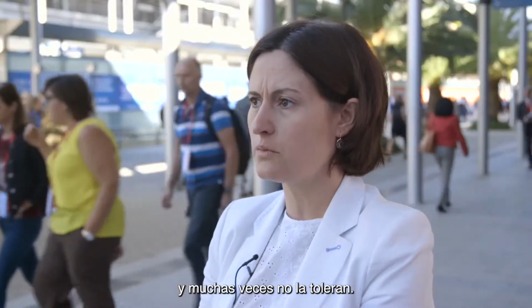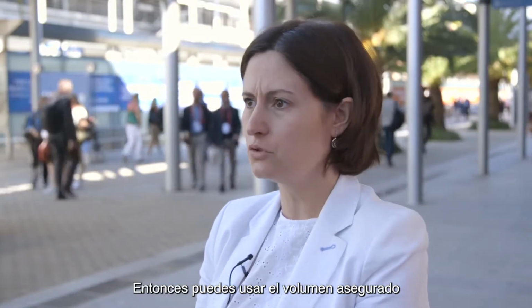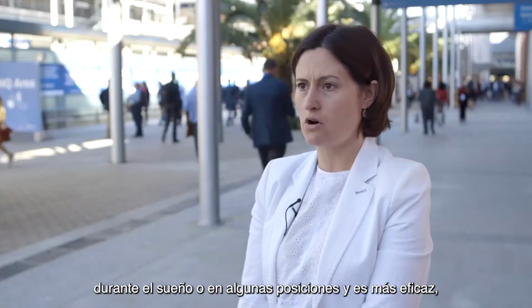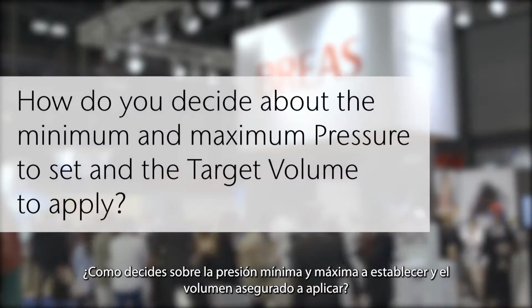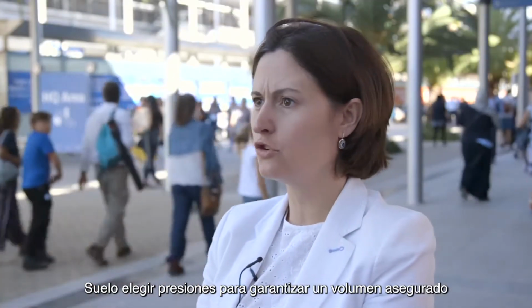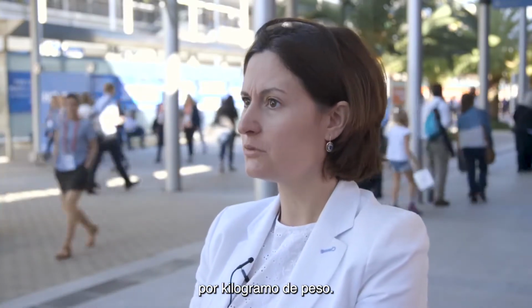Some patients, like COPD patients, need high pressures, and many times they don't tolerate that. So you could use target volume to achieve these high pressures during sleep or in some positions, and it is more effective even when there are no restrictive components. I usually choose pressures to assure a target volume between 8 and 10 milliliters per kilogram of predicted body weight.